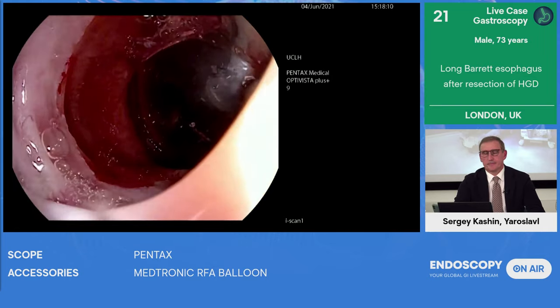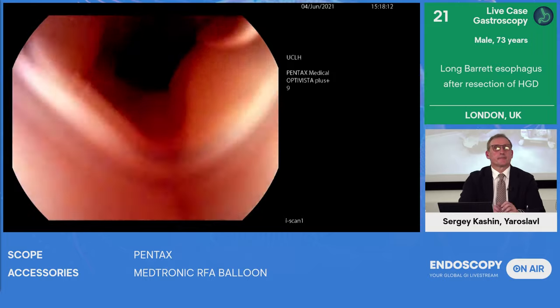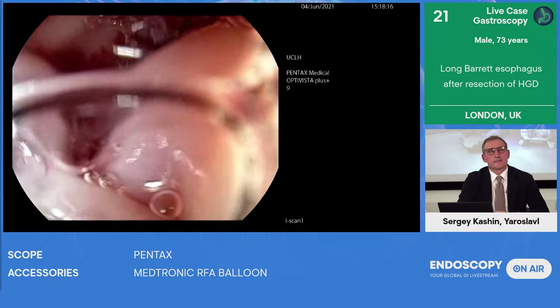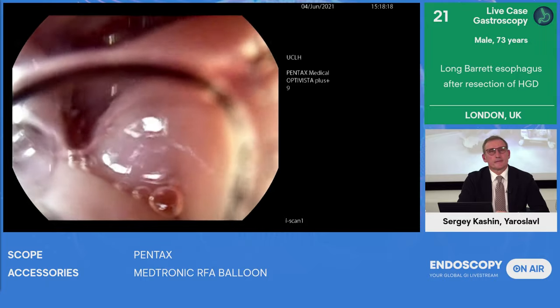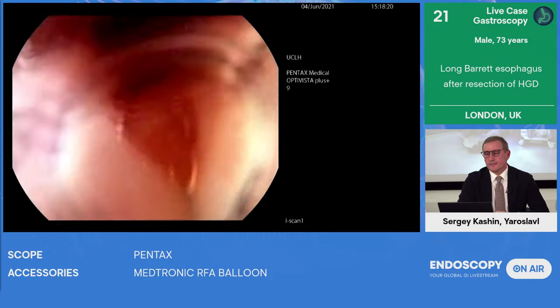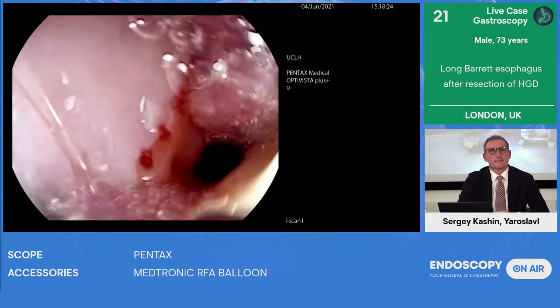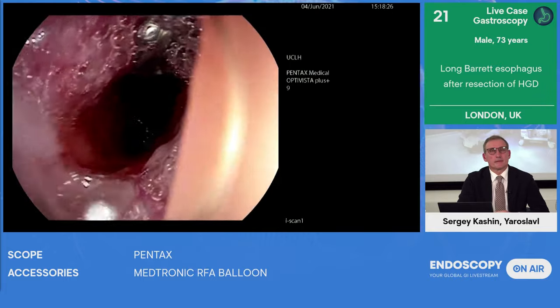So why don't you ablate there, Vinay? You've got full suction down. Because it's so narrow in the cervical esophagus, sometimes you just have to take a compromise because you know they're going to come back for another session. And before you go, we'll just show you what Vinay's done here by just showing you the ablated area.